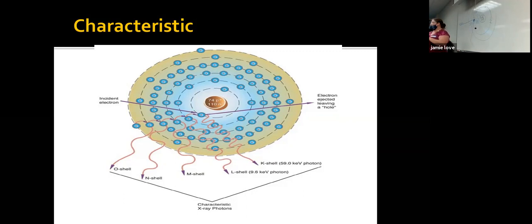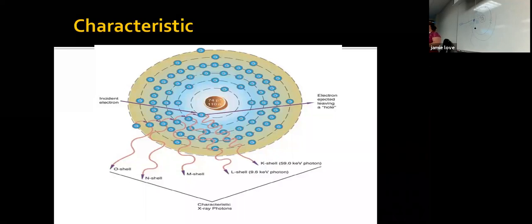You said the KVP is attracted. The KVP attracted it over. And depending on what KVP we set is how much attraction it's going to slam into it with. And when I think of the slamming, I think of the slamming into the actual slant of the metal, the anode angle. But this is creating an X-ray, right? Yep.